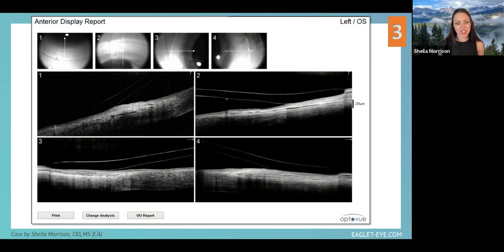Now, this is what a conventional, normal diagnostic lens looked like on this patient's eye. You can see even from the OCT, it's decentering terribly with that big belly eye. The limbus is just atrocious. You can see that huge space. There's no way that that is a healthy, safe thing to use.